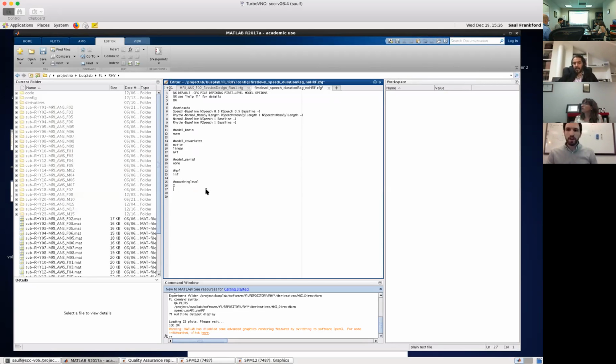Yeah, because I was thinking of trying to run it with and without adding this regressor and see what the difference is. But then I have to go change my subject files. Right, exactly. But you don't want to change all of those individual files for every subject, so you can override it just in here. Okay, all right, that's good.